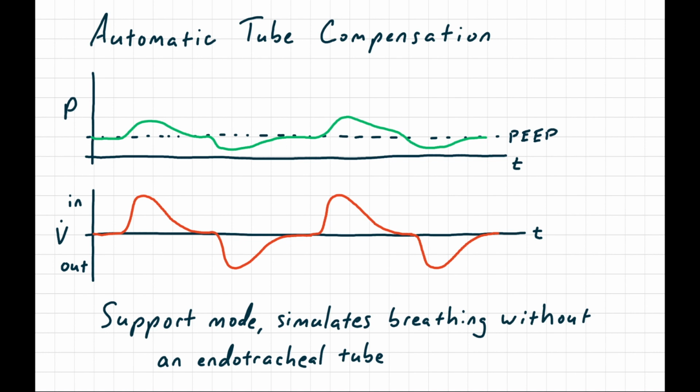This mode can be used on its own as a weaning mode, like it's drawn here, but it can also be added on top of any other ventilator mode on the advanced ventilators that support it.